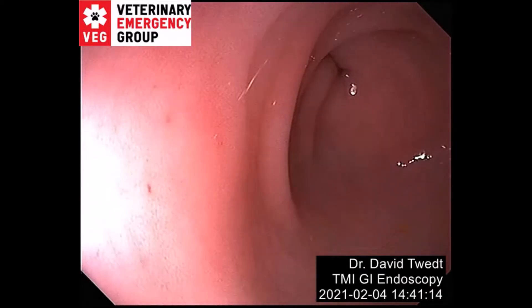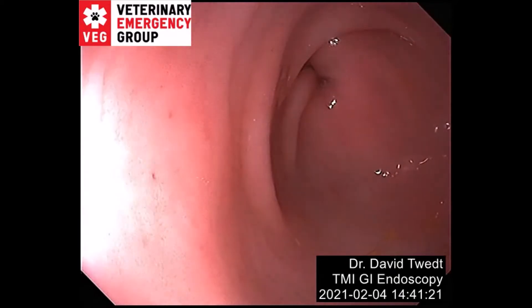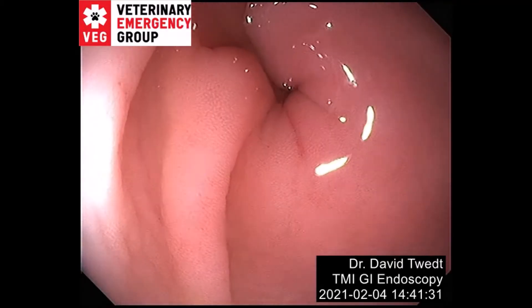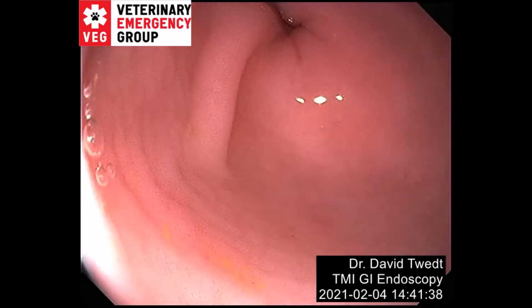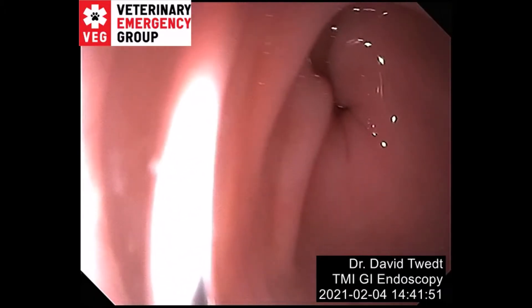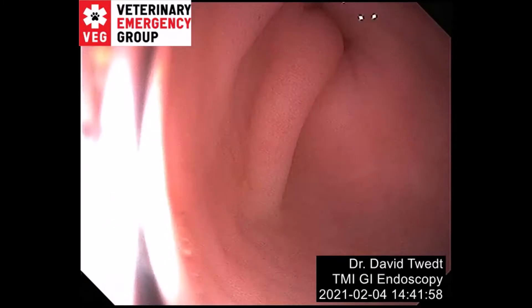The closer you get to a target, the slower you move and the smaller are your adjustments. Getting there, we should be moving four to six inches at a time — it makes no sense to move through the stomach a millimeter at a time. With foreign bodies, just like with the pylorus, have a plan and execute your plan. Every once in a while you get lucky and the snare magically grabs the foreign body for you, but that rarely happens. You have a plan in your head, and your skill is to actually execute that plan.